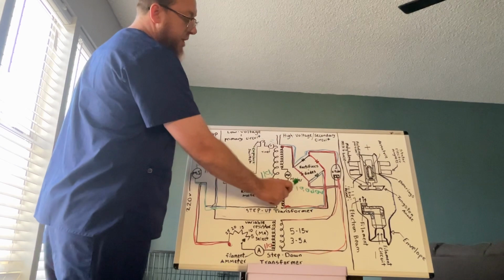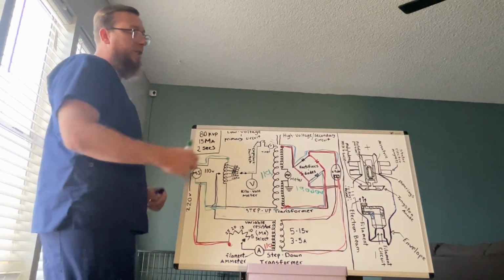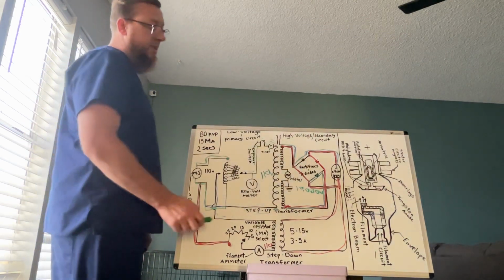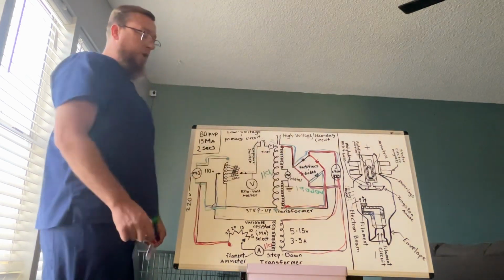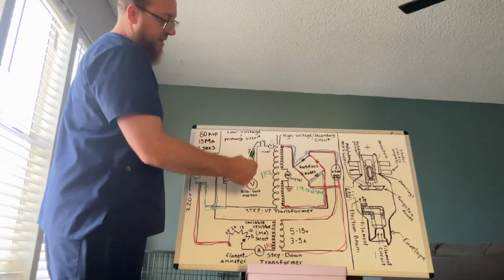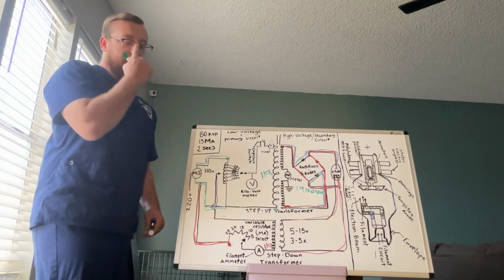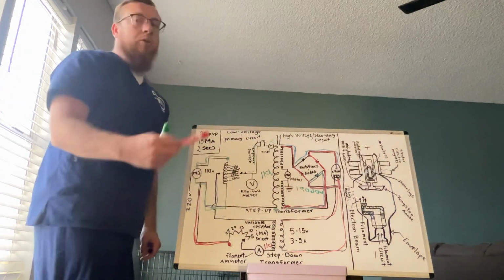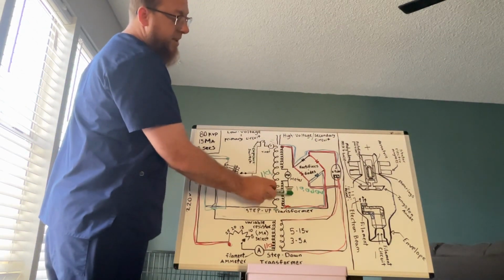this here, the mA, which is a meter, reads that the correct amount of voltage is being converted. If it's not the correct amount, let's say instead of converting from 110 to 10,000, it converts it to 6,000, what that will then do is come back into the primary side and it will sit there and it won't be used. On the opposite side, if we get more than 10,000 volts, let's say it goes to 12,000 volts, it's going to go down into this ground.